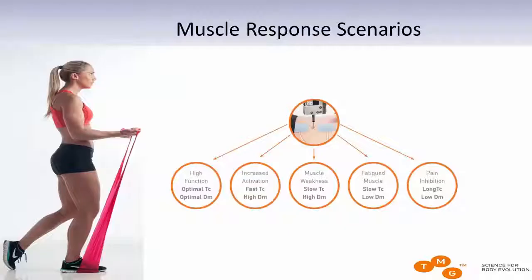So usually fatigued muscle has a change of TC of like 10, 15, maybe 20%. If you have an acute injury, it can be 100. So you can go from 20 to 40 within minutes if you do a sprint, injure your biceps femoris, and measure immediately. Then if you don't do anything for a long period of time, again the contraction time will prolong, so you will again have the shift to the right, but since you're not using the muscle as you did, the displacement will not drop, but it will increase.